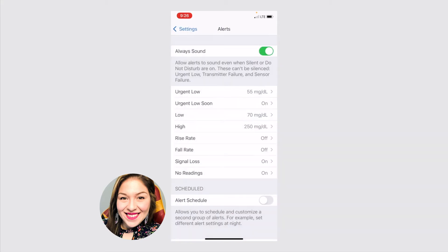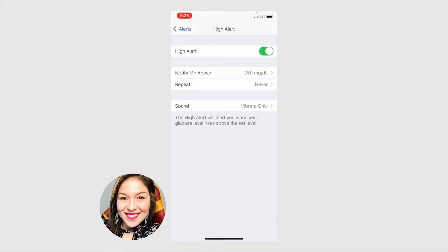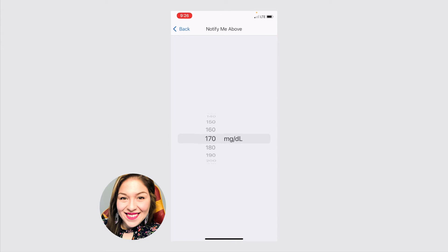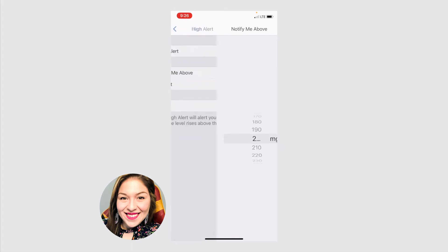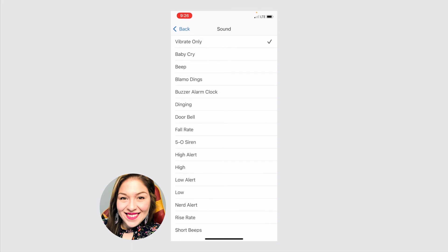You can do the exact same thing for your high. Again, you want to have it on so that way it does alert you if your sugars are going above a certain level. And it's adjustable. So you can set it to whatever you and your doctor agree on. I think standard default, it comes to about 170 or 180. And so if you want that to be a little higher or lower, you can just go ahead and adjust that. And again, you can also change the sound to whatever you would like.